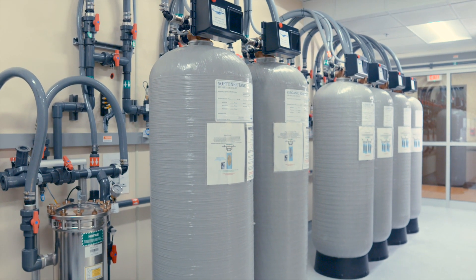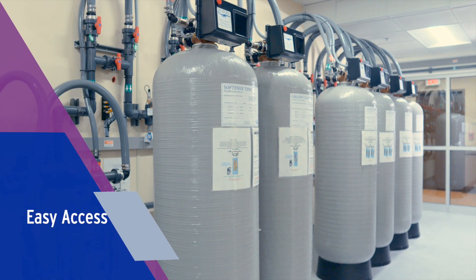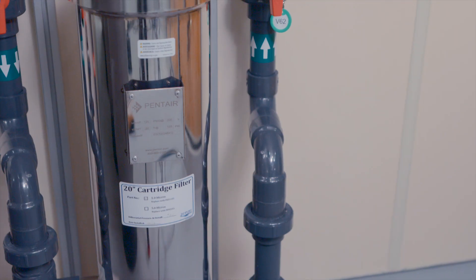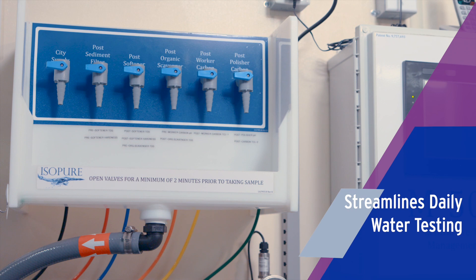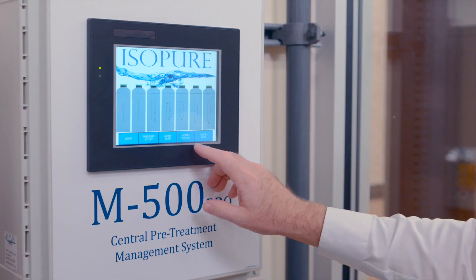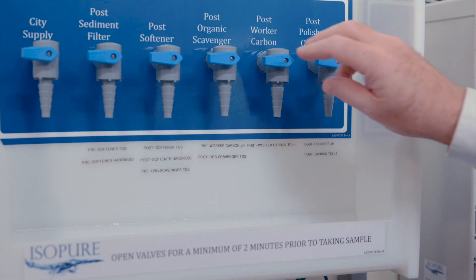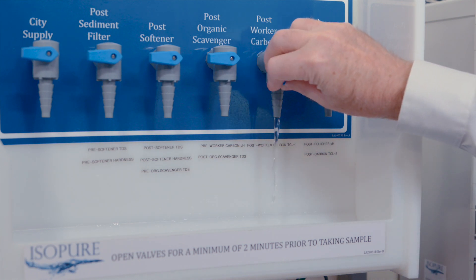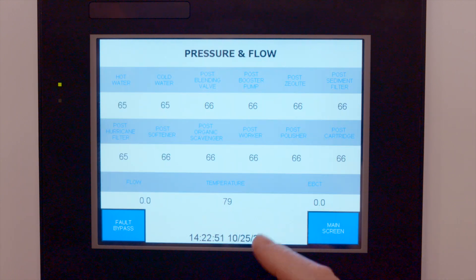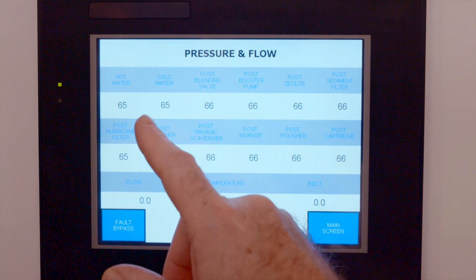The pre-treatment system offers easy access behind all of the tanks to support regular maintenance. Our sample station streamlines daily water testing. Nearby is our advanced pre-treatment monitor. With this easy access, nurses and patient care technicians alike can perform required daily tests and confirm system readings are in range.